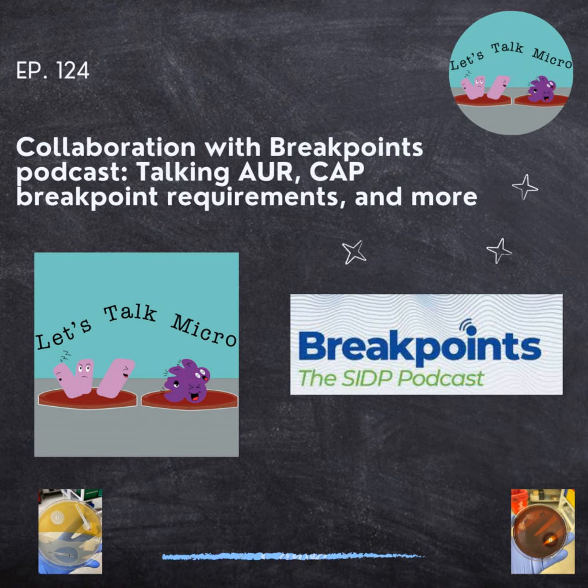Yeah. All right. So I think teamwork makes the dream work is definitely a theme of today's pod, because just personally talking with you guys helps answer a lot of the questions that I'm getting from my smaller community hospitals. One of the biggest questions that you guys have touched on multiple times is that it's within the last 3 years that these breakpoints need to be updated. And so for this upcoming 2024 year, it's anything that's pre-2021 breakpoint update.